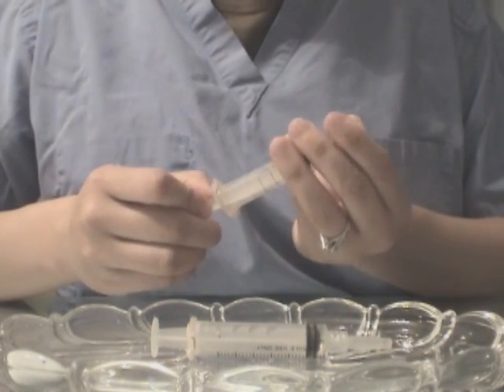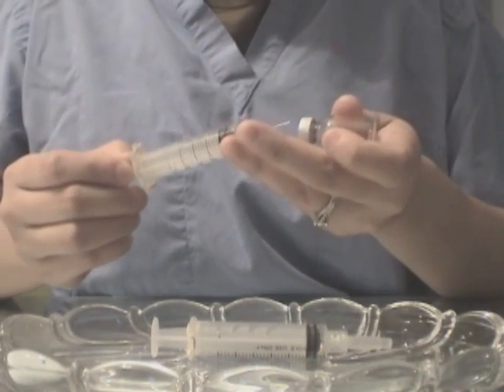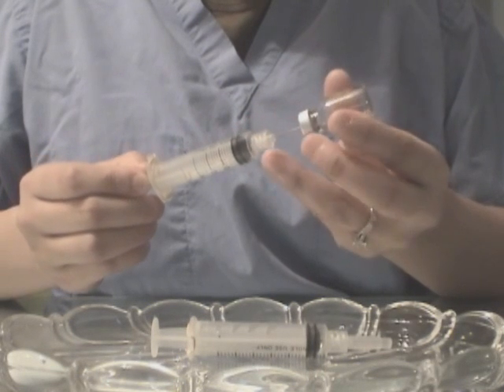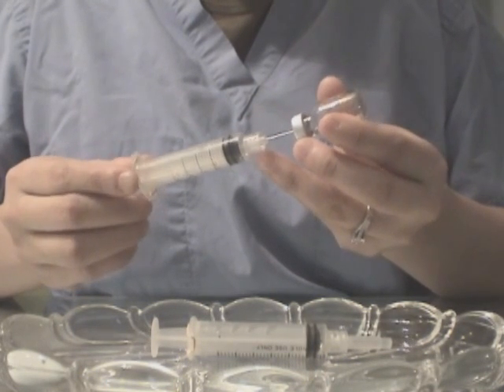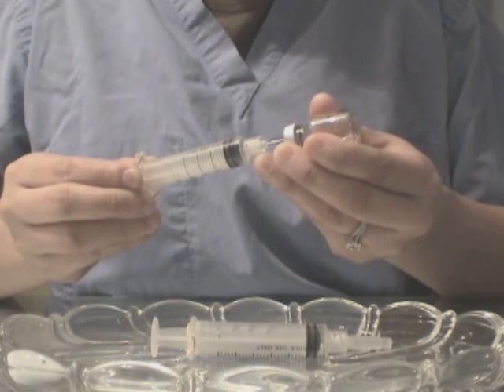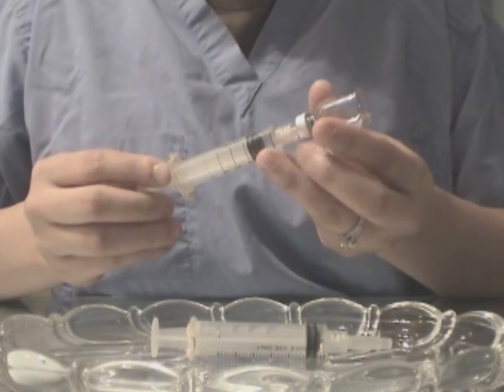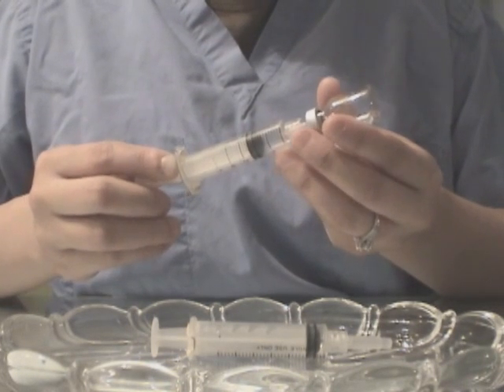First, you want to go ahead and remove the cap. Then, you want to insert the needle into the container. You want to remove as much of the liquid as you like.